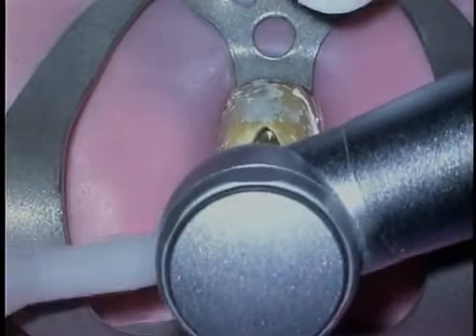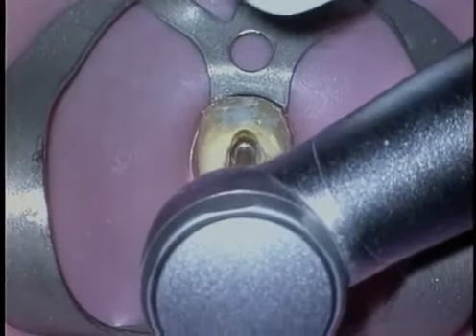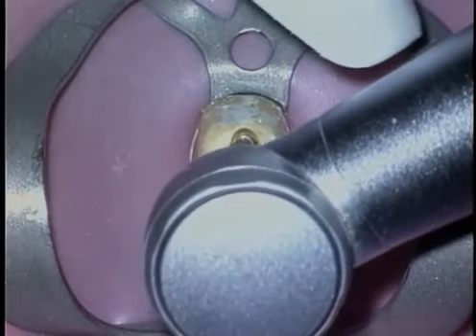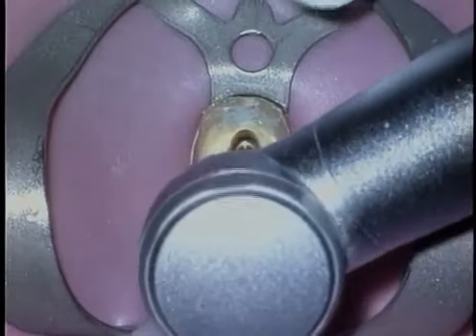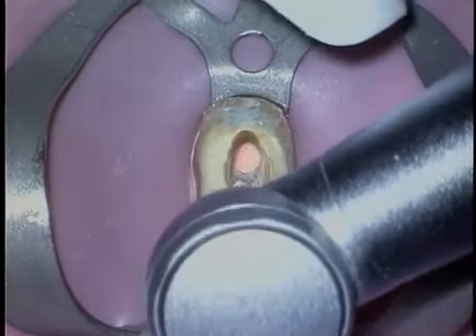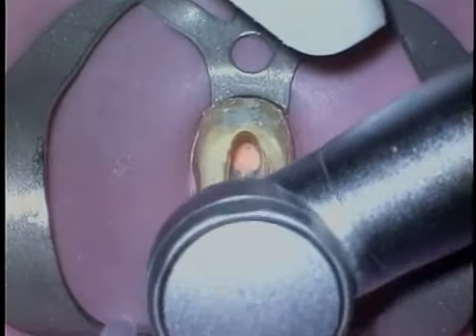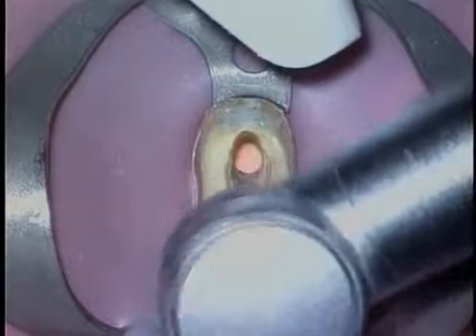Surgical length round burrs are again utilized because what we want to do is have maximum vision. Their extended lengths move the head of the handpiece further away. Notice that we found gutta percha towards the buccal. Because the gutta percha is skewed to the buccal, it suggests to the clinician to move the access more to the lingual. Of course, the preoperative films guided our pathway and let us know where to look.